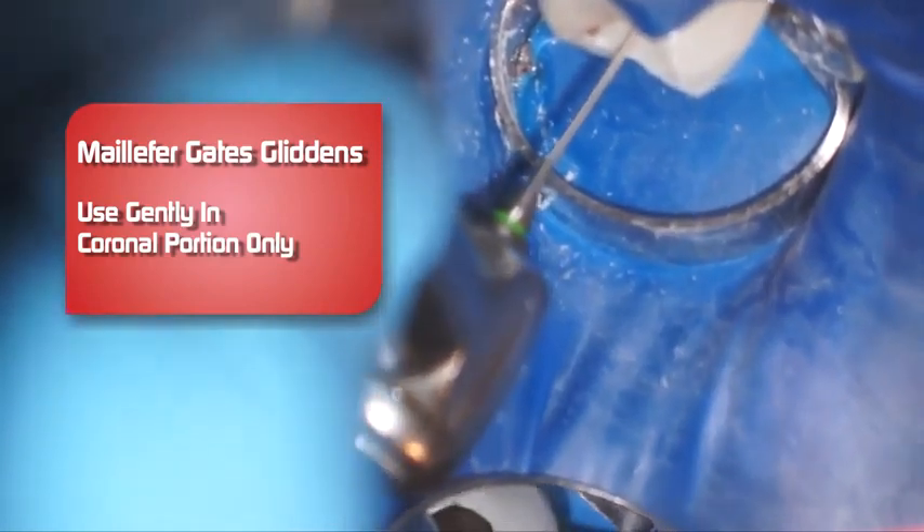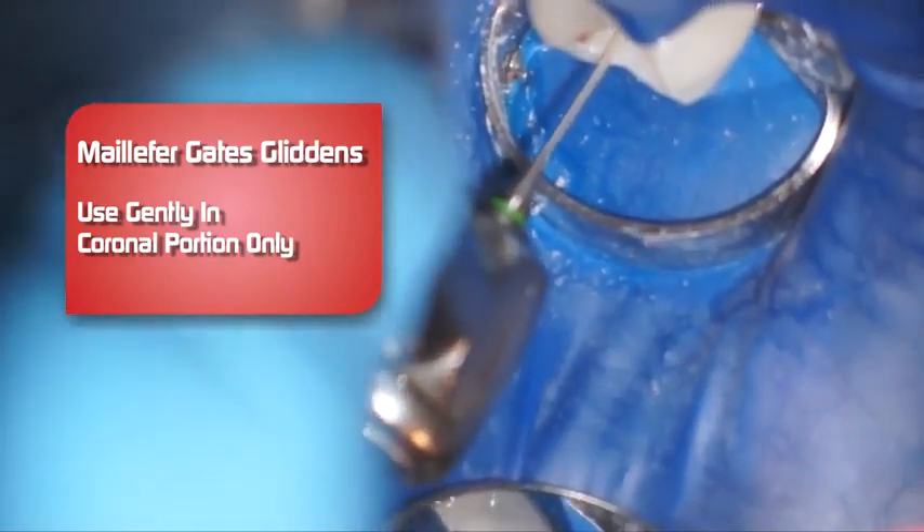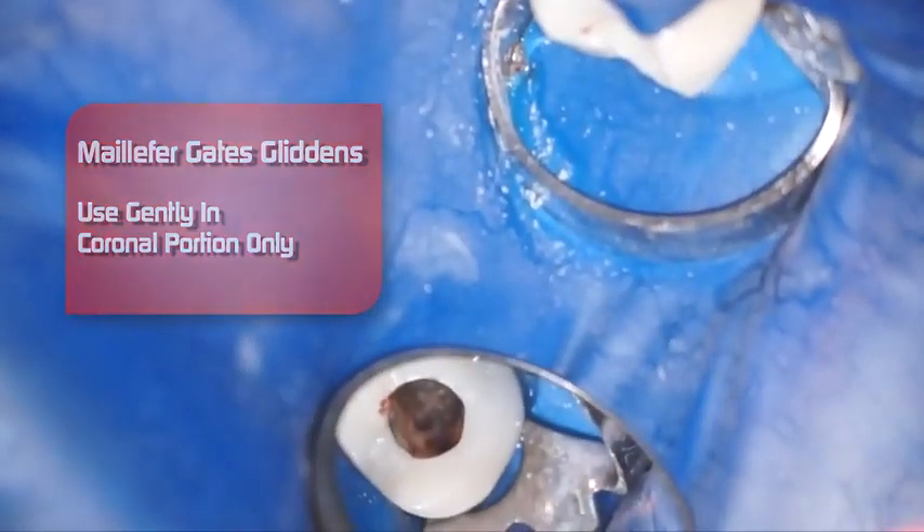Again, very gently like a paintbrush. And you can see that Gates Glidden flexing — it's a number two, so it's much more flexible than the larger sizes. I found that the quality of Gates Gliddens from Dentsply Maillefer are superior. Why don't you try them and see how they work in your hands?